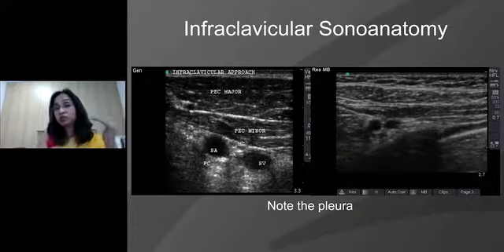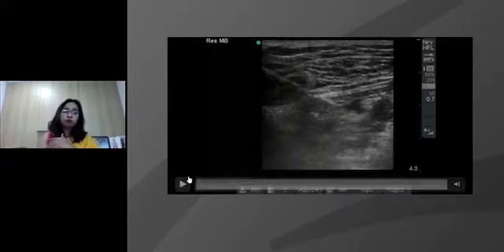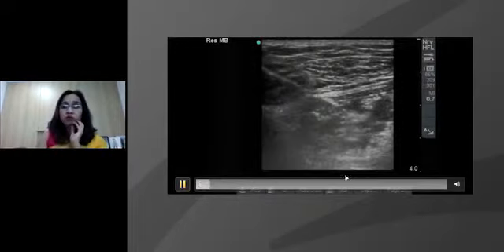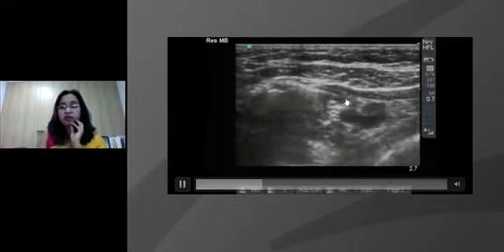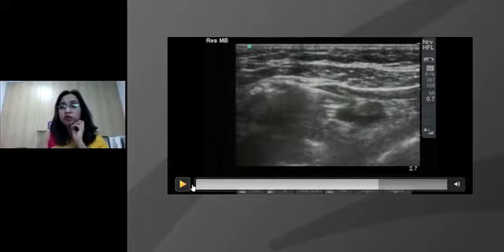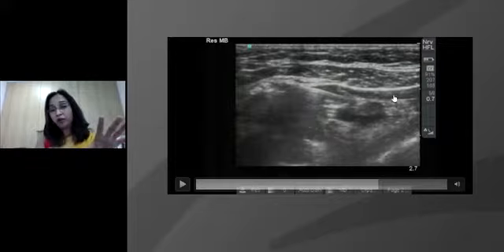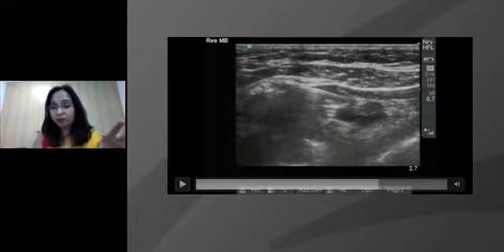As we just said, too much superficial structure is also not a very good advantage. So in one go, we can place, at times we can go even ahead, but what remains crucial here is really to separate or go beyond the fascia that covers the pectoral. Otherwise, we could inject intramuscularly and we wouldn't get a block. And look at the pleura all the time.